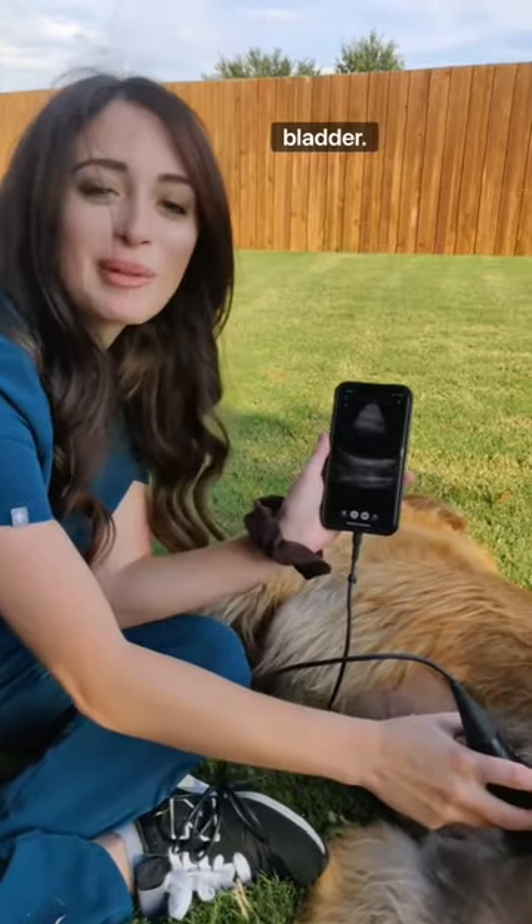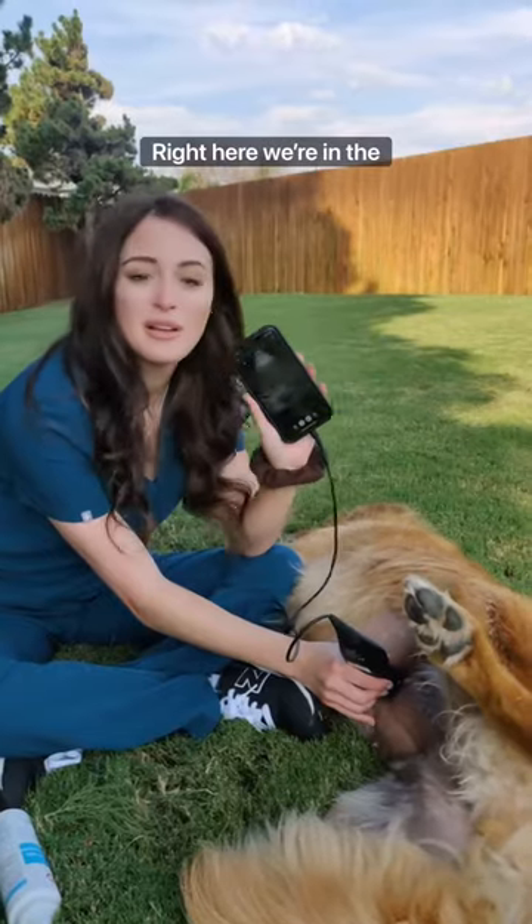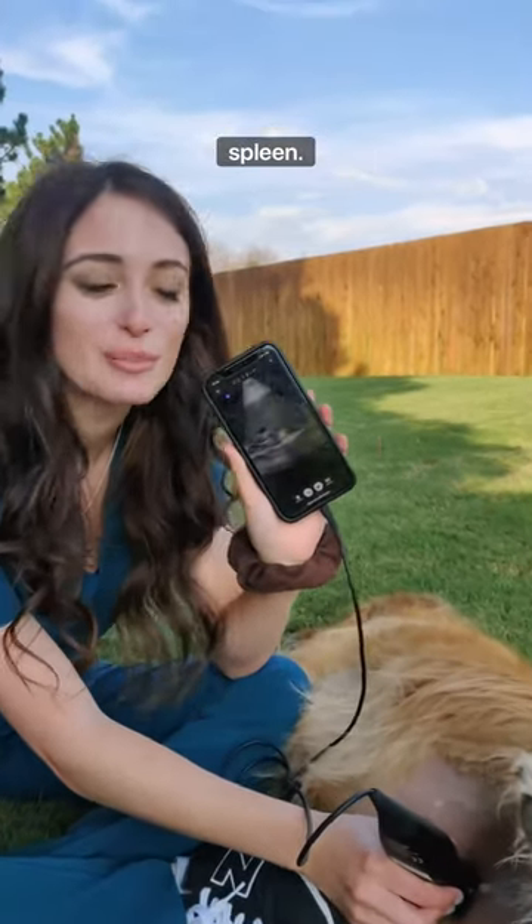Right here you can see her bladder. And here we're in the mid-abdomen and I have a really good picture of her spleen.